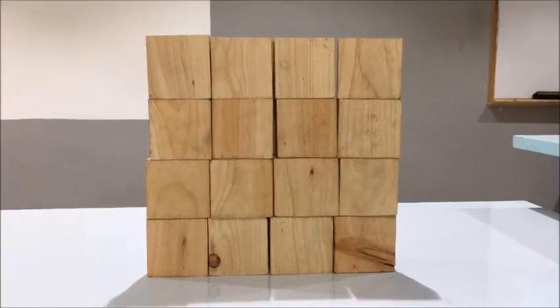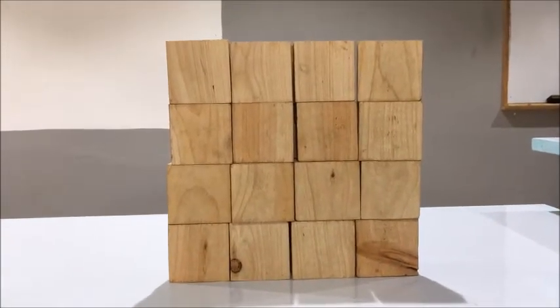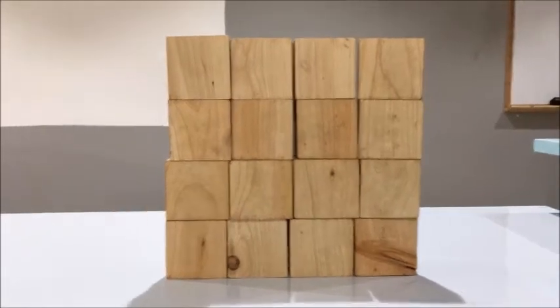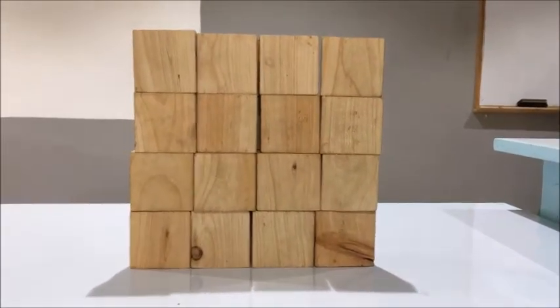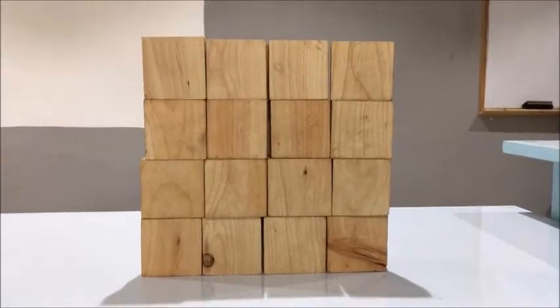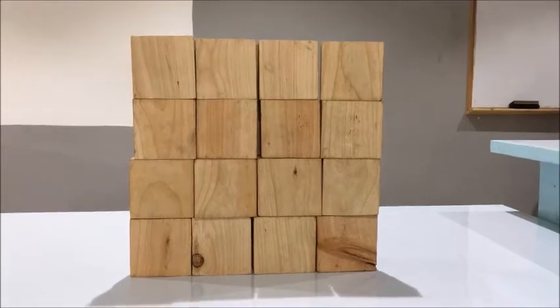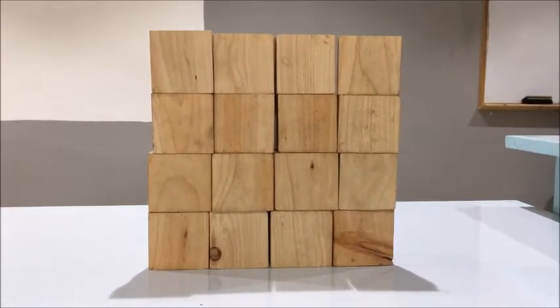So here I have an object. I'm going to show you how in slices I can find out exactly what it is. Each square there represents what we call a voxel, which is like one three-dimensional unit, a bit like a pixel of whatever that object is.